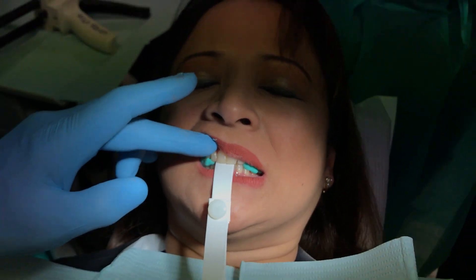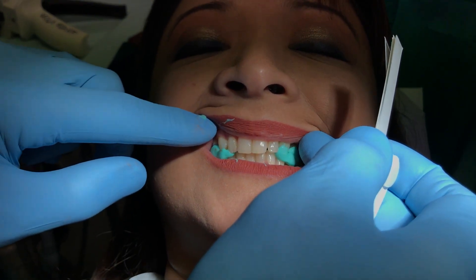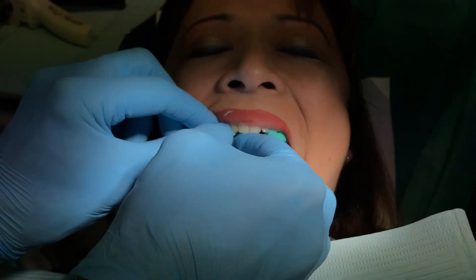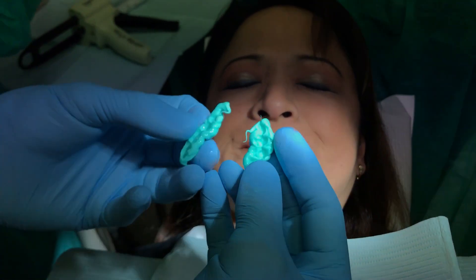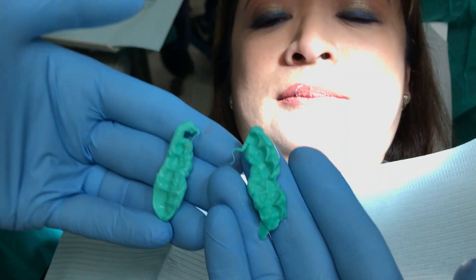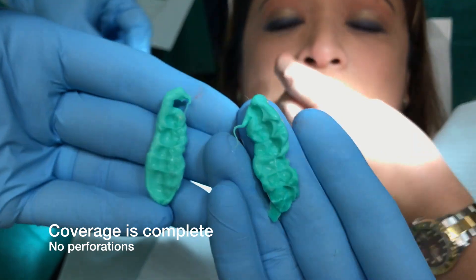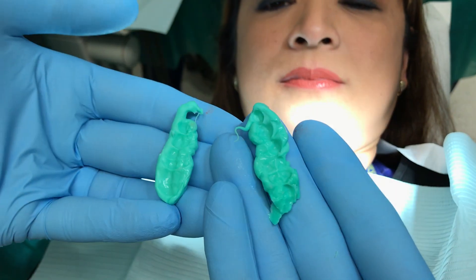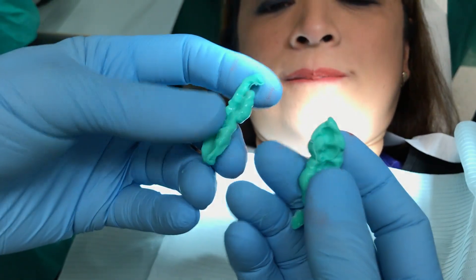It's important to have your patient rehearse this. Open for me, then bite down again into the material. We're going to go ahead and take out the individual little bite records. If you look at the bite records, you can see that there's good coverage and there aren't any areas where it's perforated through the teeth. The bite records are covering the second molars, first molars, second premolars, first premolars, and maybe a little bit of the canines. These will now need to be trimmed before we can take the casts and mount them up. If you want to make sure you've got a good centric relation record, go ahead and take a few of these.